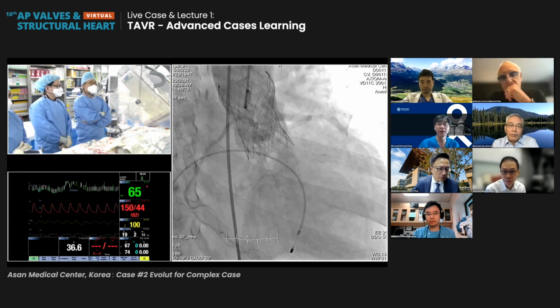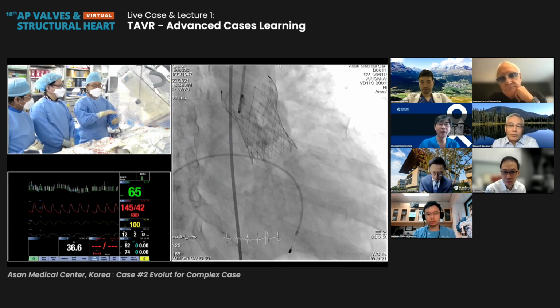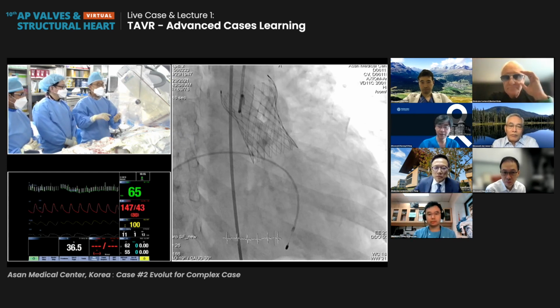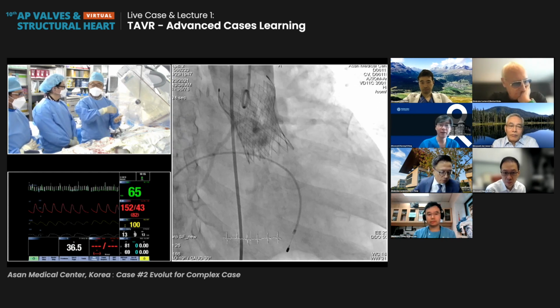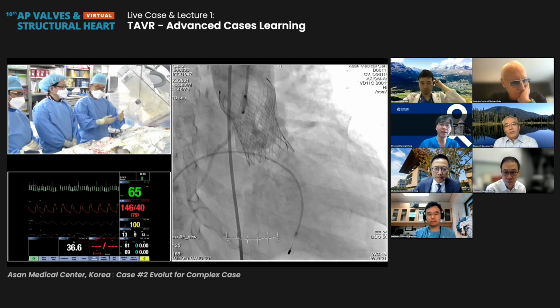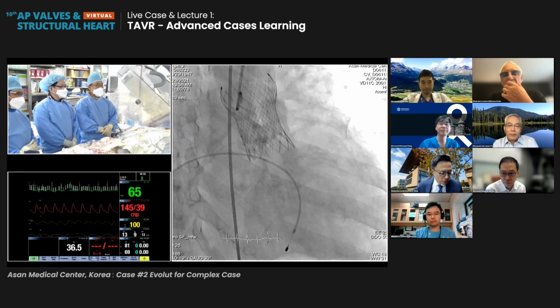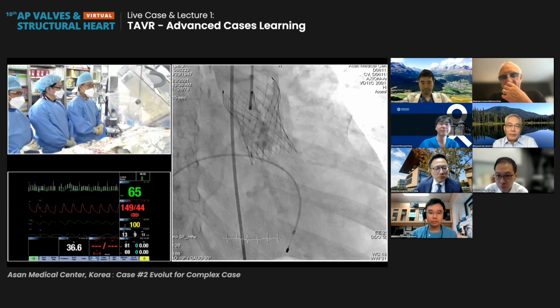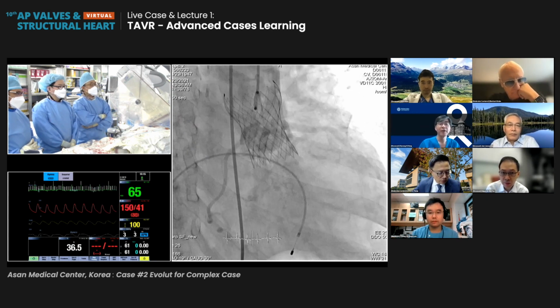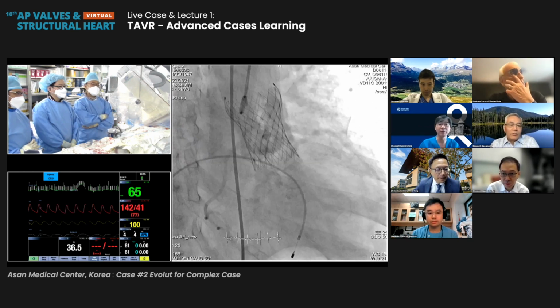And the second one is... Yes, we recently published how much ejection fraction impacts prognosis in the American Journal of Cardiology, and one third immediately go up, within 1 or 2 days, and the ejection fraction is much improved. I hope that this patient is much improved, and some patients show a slow gradual increase of the ejection fraction. That article shows what predicts ejection fraction improvement. Yes. One of the impressive findings after the TAVR procedure is the pressure monitoring over the left ventricle: the LV end-diastolic pressure was 15. It's a very excellent result.